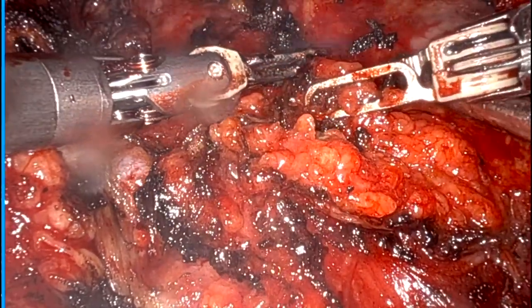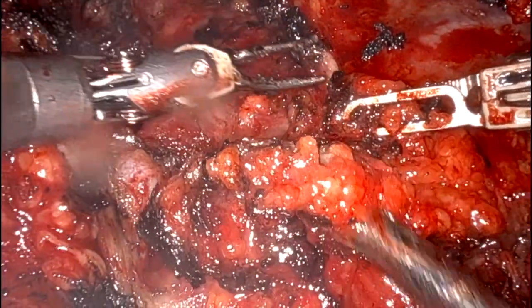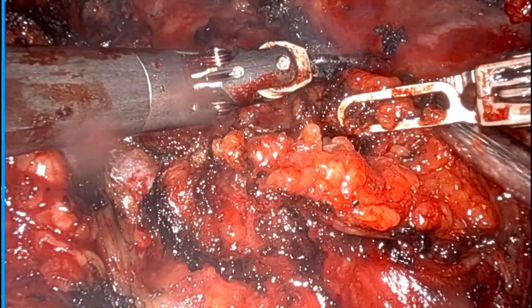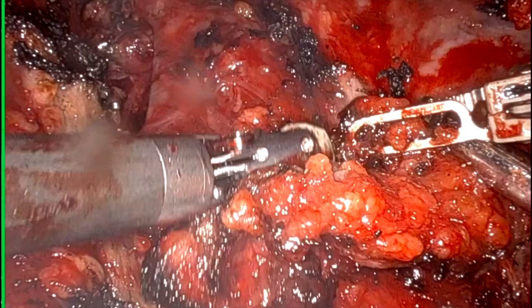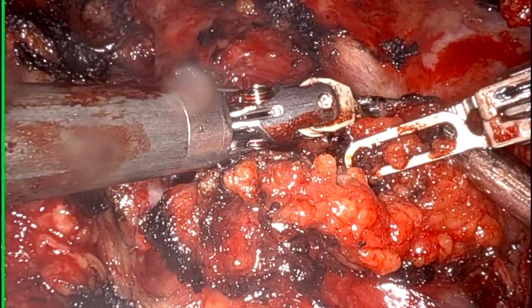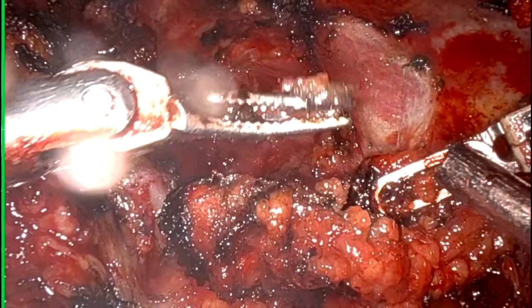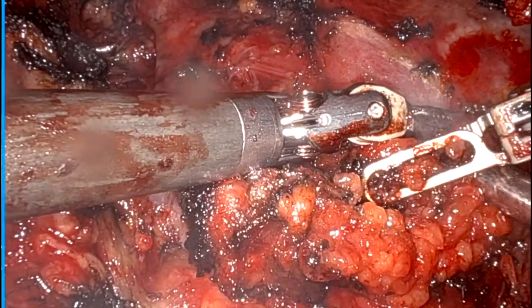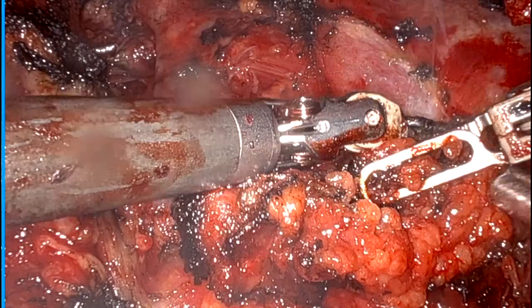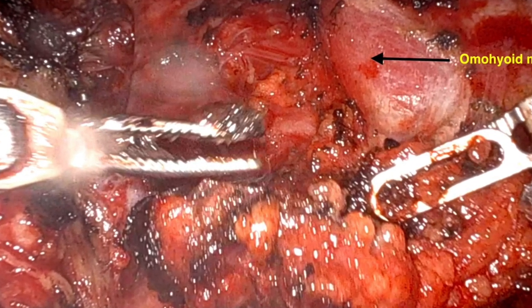After lateral dissection, now I came medially. So you can see the fibers of omohyoid muscle. I am taking tissue from omohyoid muscle. Now you have a better picture. You can see in this figure the black arrow is omohyoid muscle.